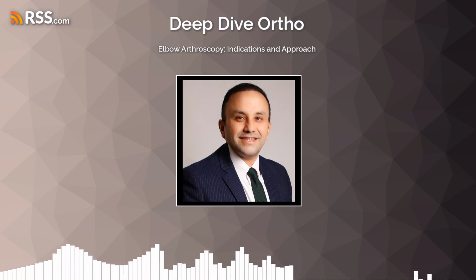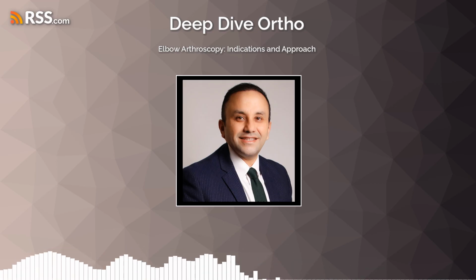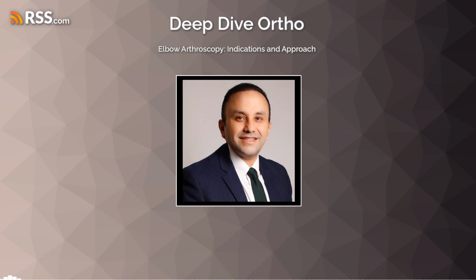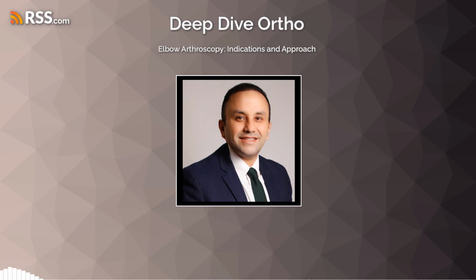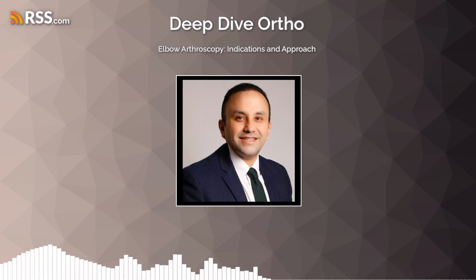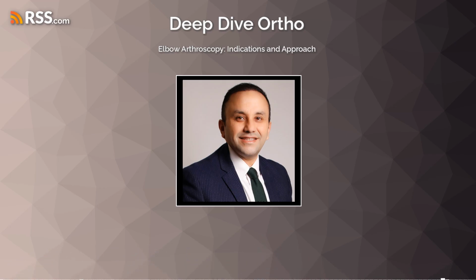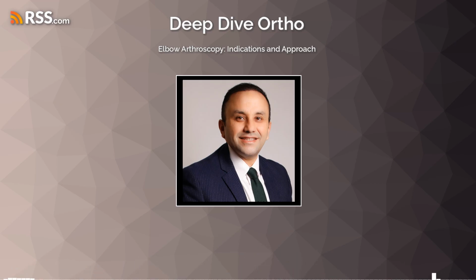There are two main endoscopic techniques. The wet technique, similar to joint arthroscopy with saline inflow, where the bursa is resected from the inside out, and the dry technique, which is increasingly preferred for olecranon bursitis. This method uses hooded endoscopic equipment. A 2-3 centimeter incision distal to the bursa allows scope introduction. Subcutaneous tissues are elevated off the bursa and olecranon, and a pituitary rongeur resects the bursa through a separate proximal portal. Cautery is used for precise bleeding control.